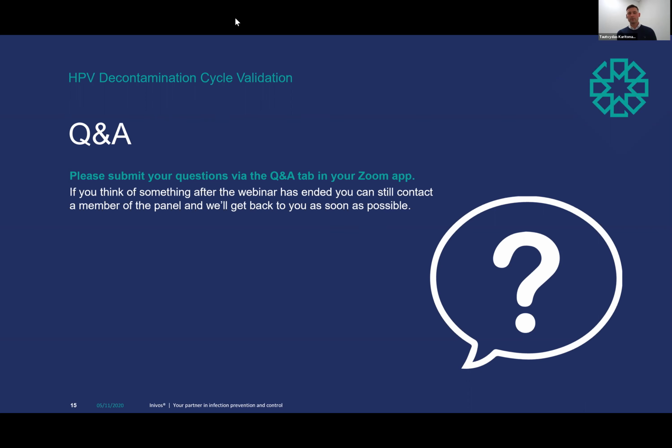Now, clearly, there are attempts to use specific cycle indicators like chemical indicators or enzymatic indicators. I think we as cycle developers and technology developers are trying to find ways to get you a result you can rely on straight away without having to wait, because we know the pace of healthcare. So I believe the future is that if we develop cycles using these electronic indicators to make sure we get the right level of efficacy, we should use the same electronic indicators to validate our cycle, which provides, from my point of view, more reliability than chemical indicators that only monitor single cycle parameters.